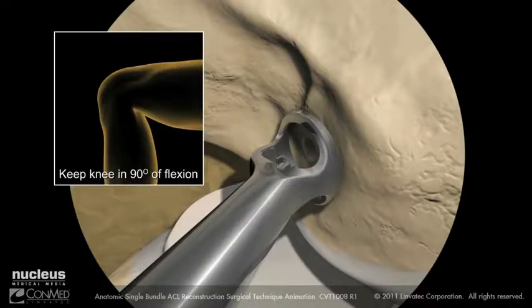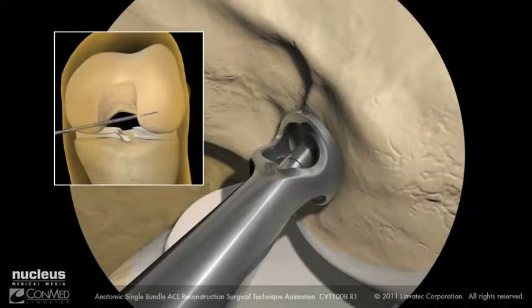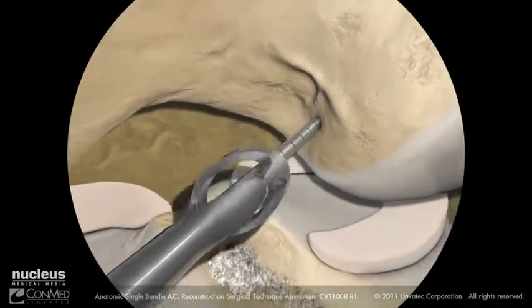Using the guide to position the guide pin, hyperflex and elevate the knee. Advance the guide pin to the lateral femoral cortex, noting the aperture to cortex depth, then advance it out of the skin. Continue advancing the guide pin out through the skin laterally, using a twisting motion to remove the femoral footprint guide.